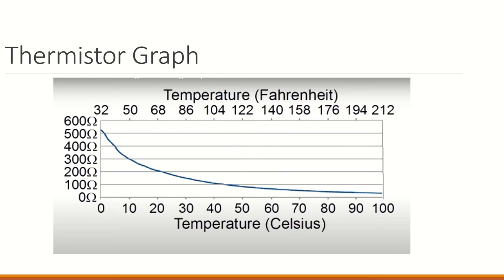Now, I do not want to get too technical with you with that. So, the basic idea is this. As you increase the current or the voltage in the circuit, the temperature increases. Yes, the temperature increases, but at the same time, the resistance starts to decrease. Now, if the temperature decreases, then that simply means that the current or the voltage has fallen and your resistance starts to climb or go up.